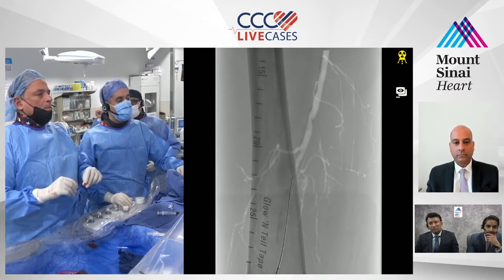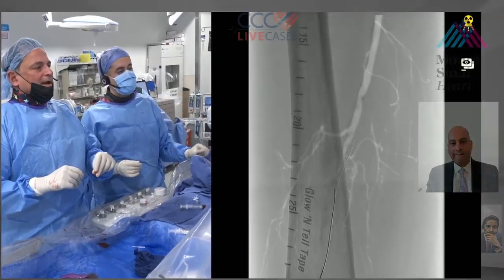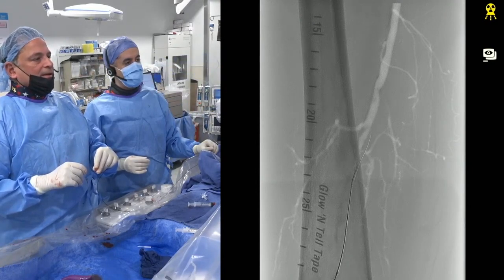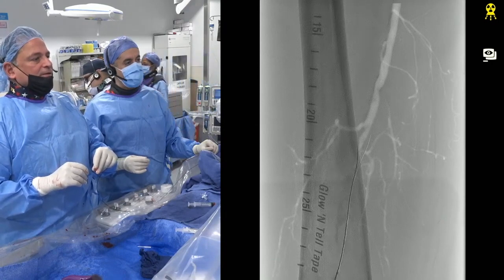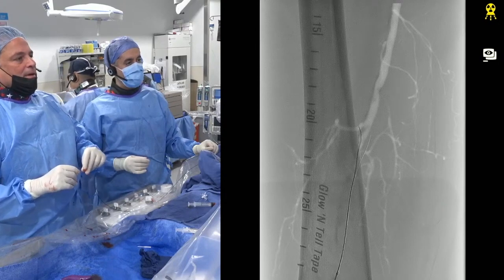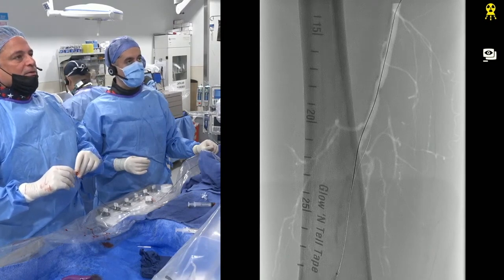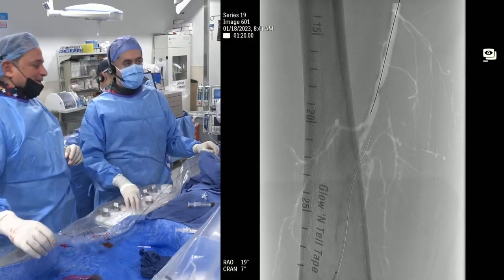Agreed. Yeah, we have a great approach. I think we're getting ready for our Outback here. I'm just trying a few things while we get the Outback ready. I think we're going to have to do a balloon angioplasty of this segment and then take it from there. It's either calcium just keeps pushing me out, and that's going to be the problem. Which wire is this right now? This is the Connect 250T, which I think crossed. Yeah, it just crossed as we opened the Outback.